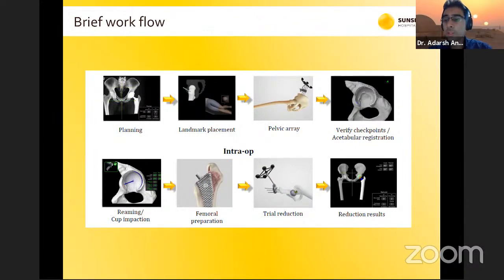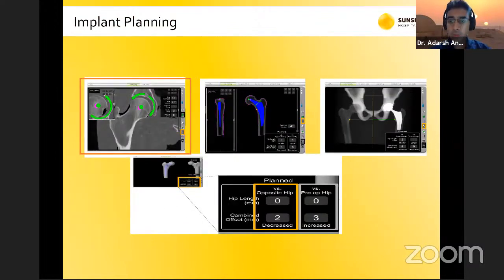And after your trial reduction, it'll give you your reduction results and tell you whether your pre-operative plan is actually matching what you have implanted.